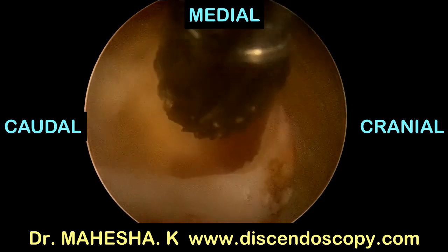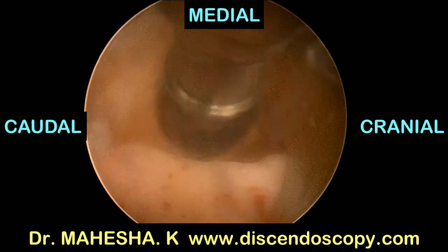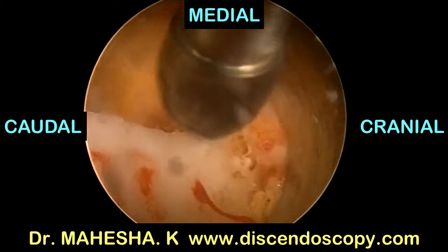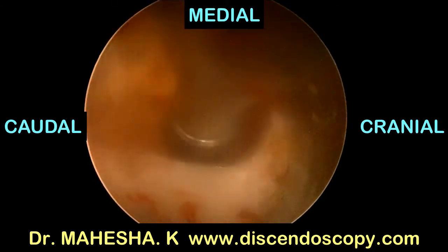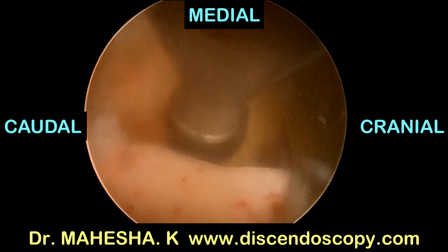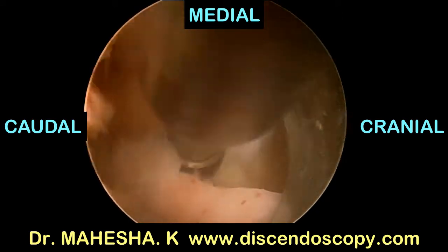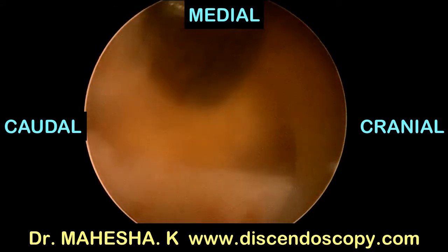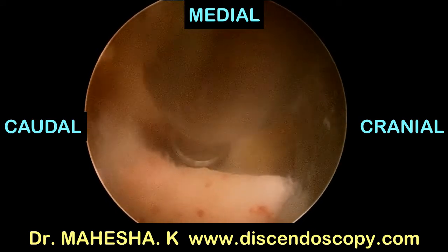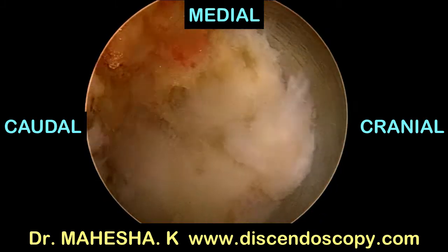Now I am using a 4 mm oval bur to fine-tune the facet resection. This burr helps in fine-tuning the facet resection and also helps in controlling the bleeding. Ligamentum flavum always protects the dura from any injury, and the burr tip is blunt so it will not cause any dural or neural injury.